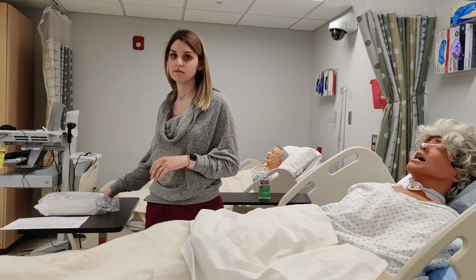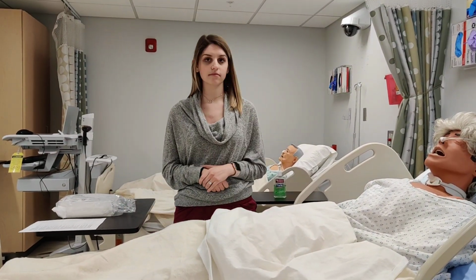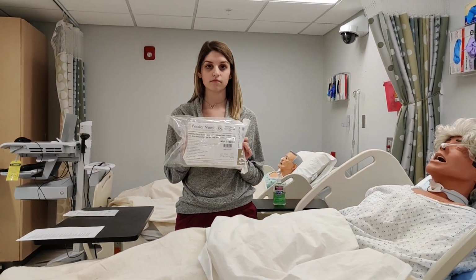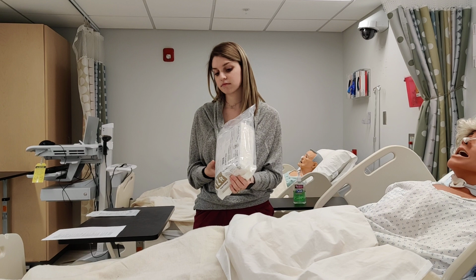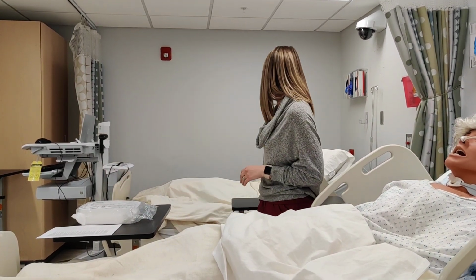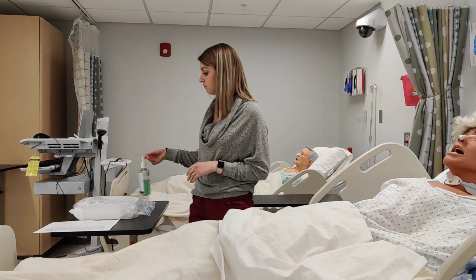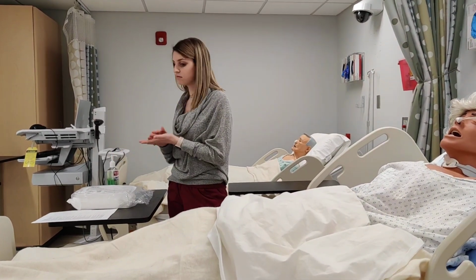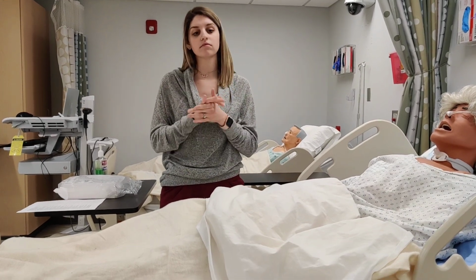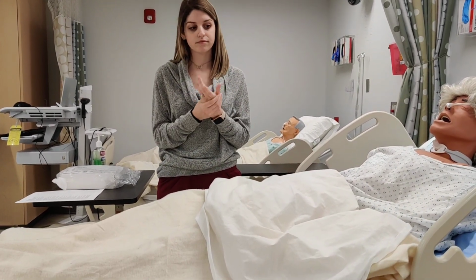Hi guys, today we're going to work on placing a urinary catheter. A couple different ways you can place one. Today we're going to do an indwelling catheter. In the clinical setting, you will learn about straight catheters. Those are catheters that are not left in the bladder. We simply remove the urine and then take the cath back out again.